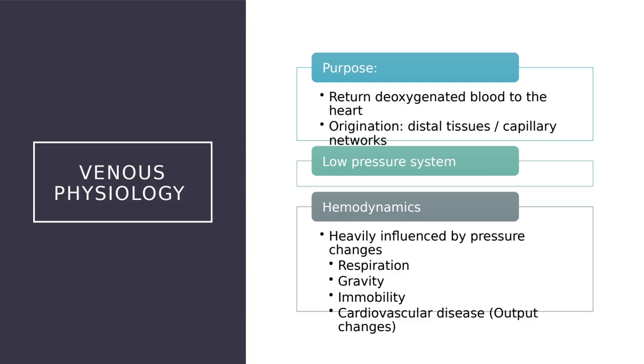So if you've seen a DVT study performed in clinic before, you've probably noticed that when they're at the top of the patient's leg, they call it prox. When they're at the mid leg, they call it mid. And when they're down closer to the knee, they call it distal. Anatomically, that's incorrect.